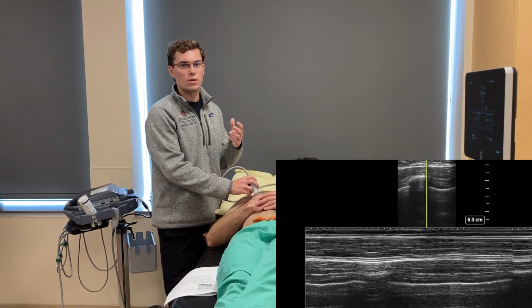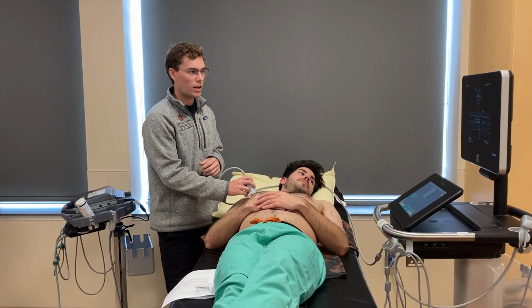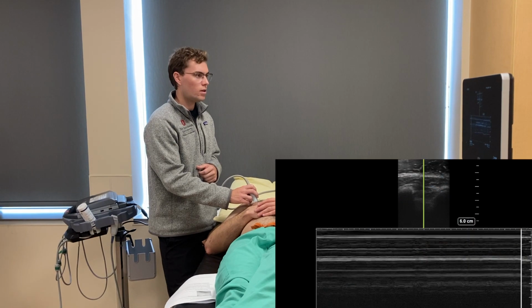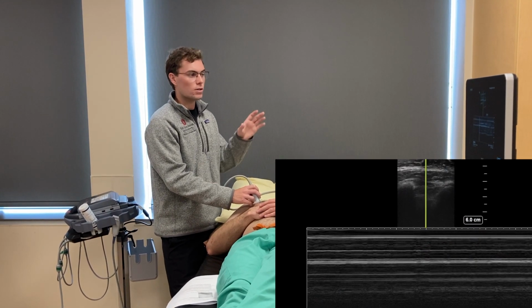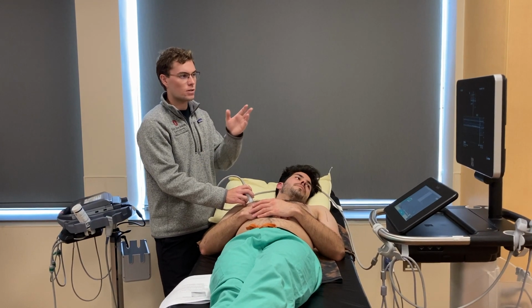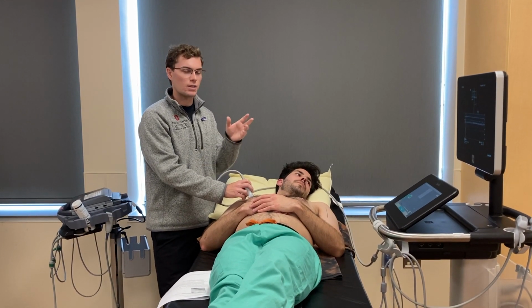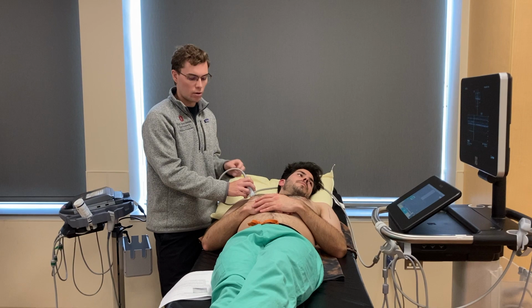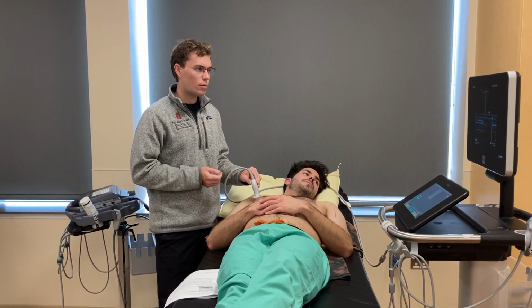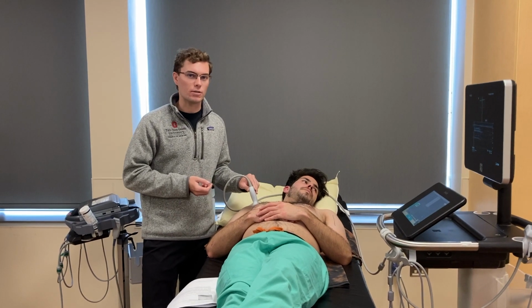And then to simulate what a pneumothorax would look like, you can ask your proctor to hold his breath. Hold your breath. And then this is going to be the barcode, just like a barcode across the screen. In a patient with a pneumothorax, this is what it's going to look like, because it's not detecting any movement of the pleura.